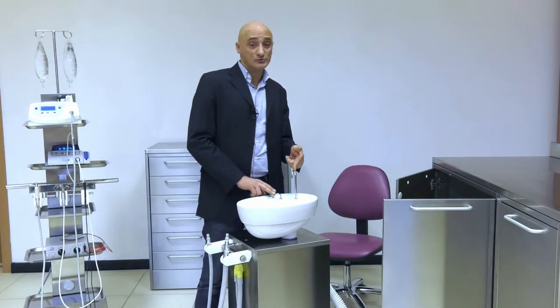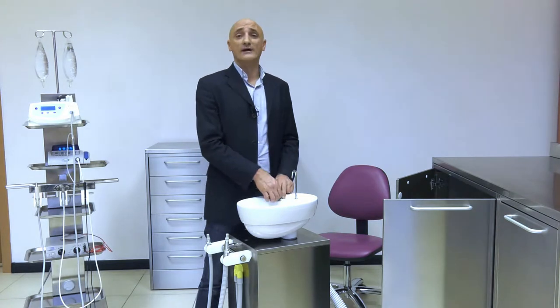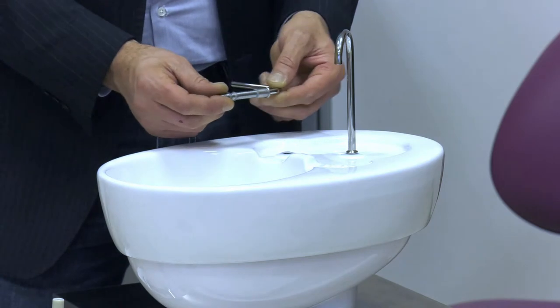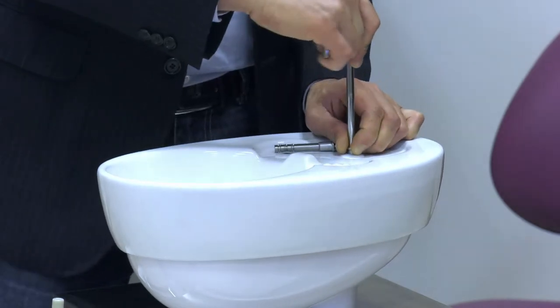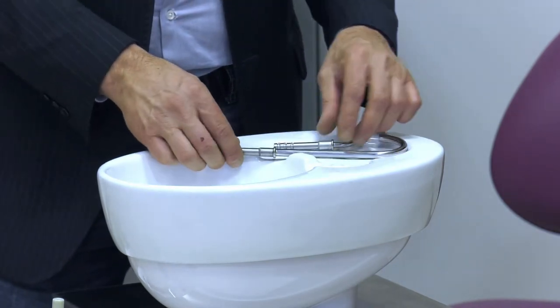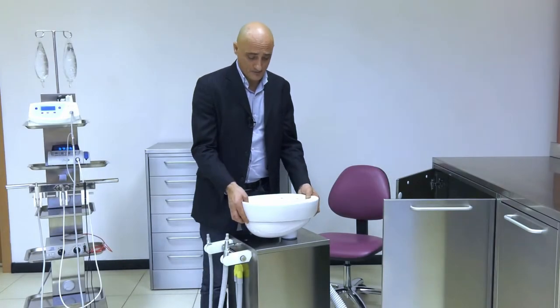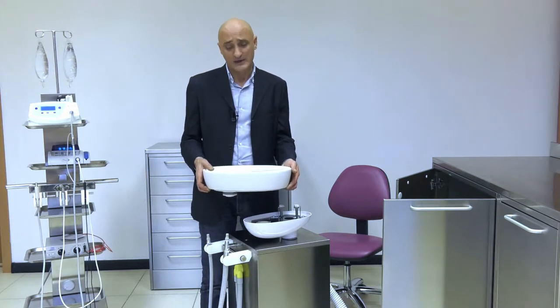Both the cuspidor nozzle and the cup nozzle are entirely made of steel, removable and washable in an autoclave unit. The cuspidor can be taken apart in order to be placed in a disinfector.